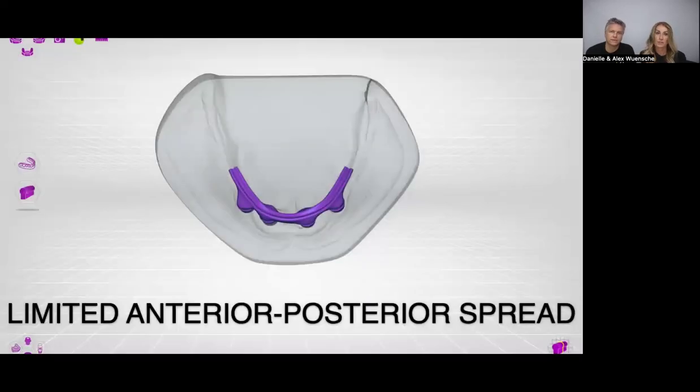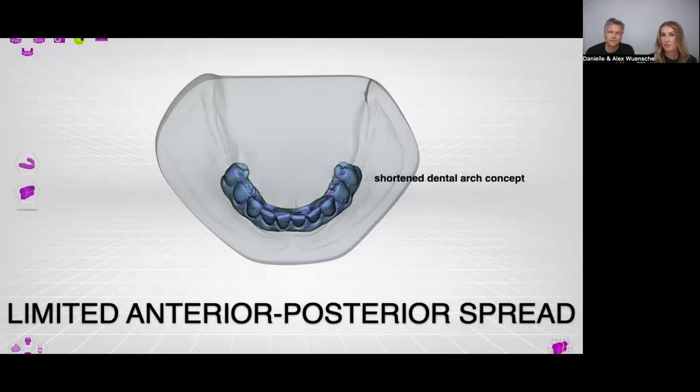That can't be beyond the cantilever, right? Yeah. So in this patient's case, because she only had four implants placed in a certain area, we were limited with the anterior posterior spread. So we had to end with a second premolar. In this case, you can also do 1 premolar and 1 molar in a restoration, but it worked beautifully for her at the end.